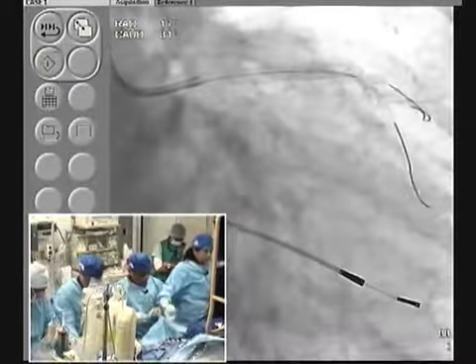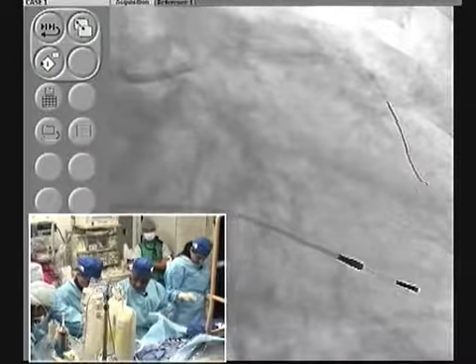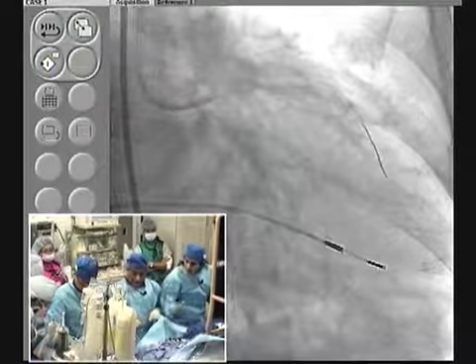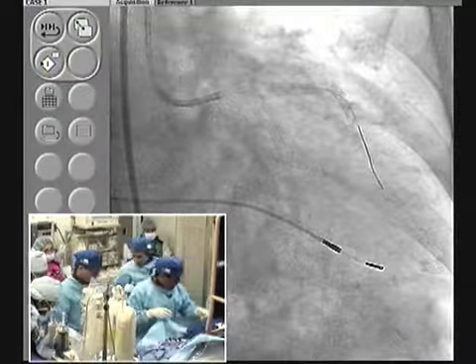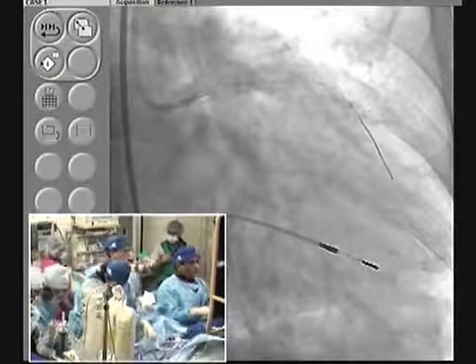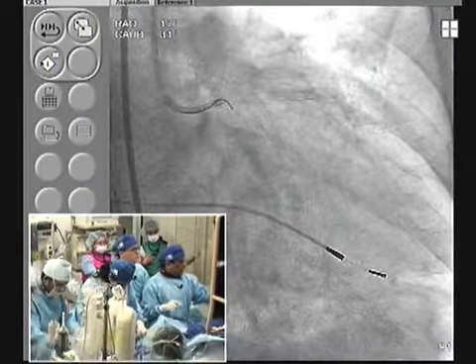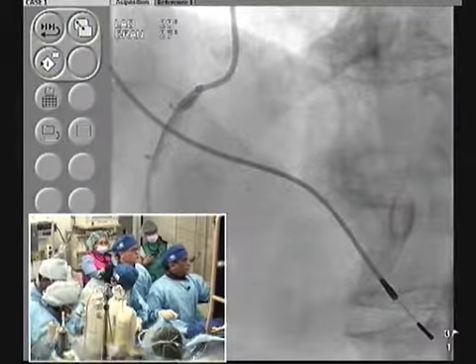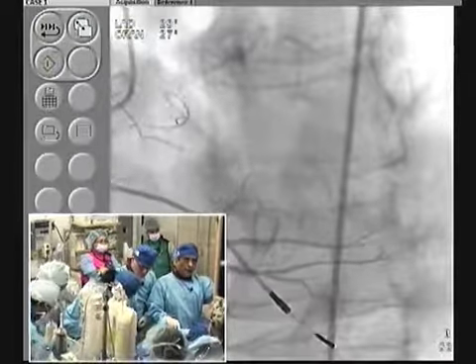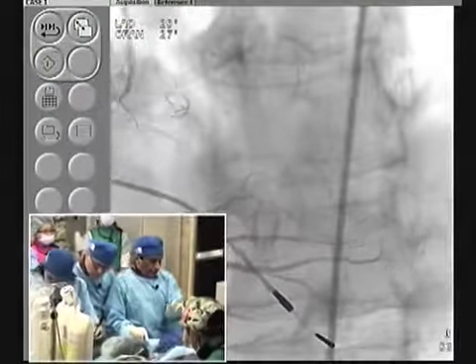I think we have a possibility either to demonstrate the OCT or chase the right coronary artery with 5 minutes to go. The right will actually take a little time. But I think our purpose today was the same. The right will be the same, the rotablation, and then stent. Because Medina classification wise, the right coronary artery has a proximal, distal, and nothing in the side branch. There is a 1-1-0, therefore proximal, distal, and the PDA being the main vessel.